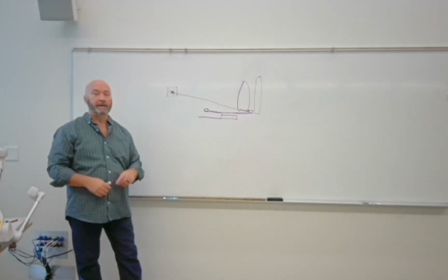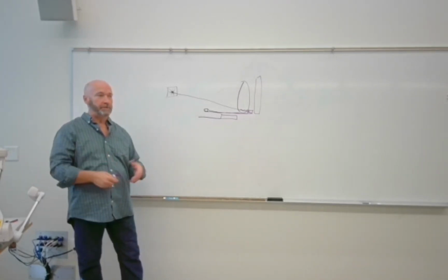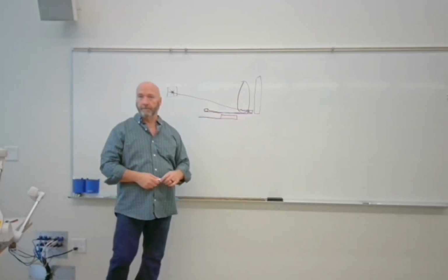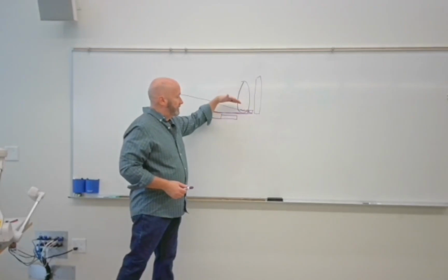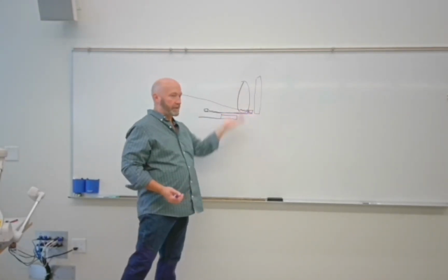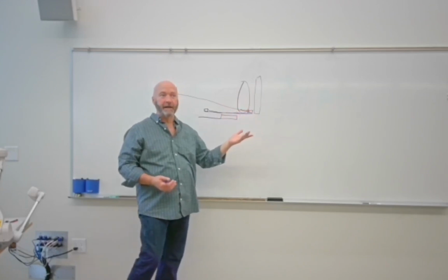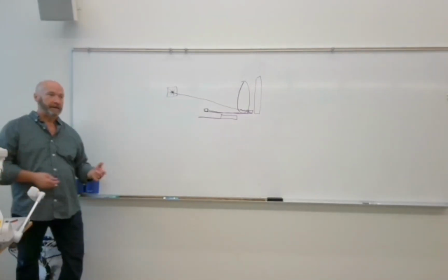Build the patient up, exactly. So you're going to take some towels, sheets, one of those big square things, lay the patient on it to overcome that, right? Because of the divergence of the central ray, you will project a small pleural effusion into the support system, so you have to build the patient up so that doesn't happen. So both of them have benefits, both of them have drawbacks.